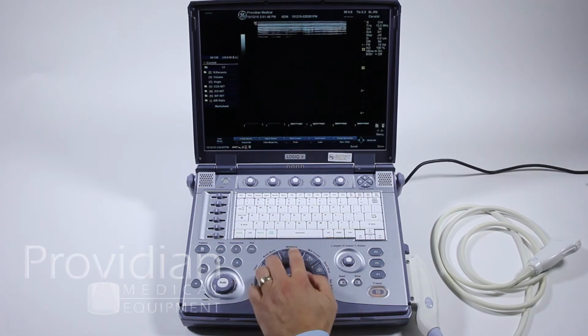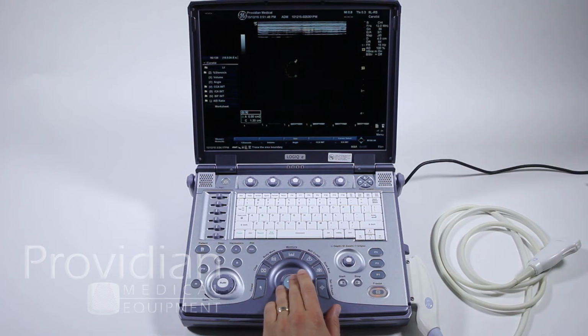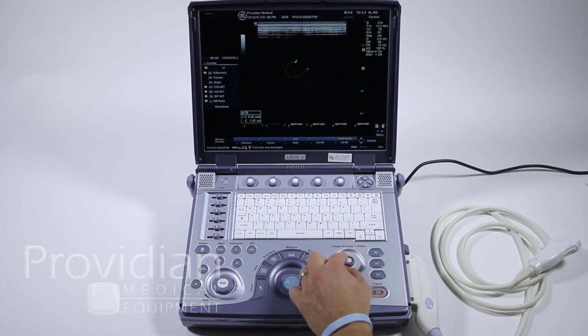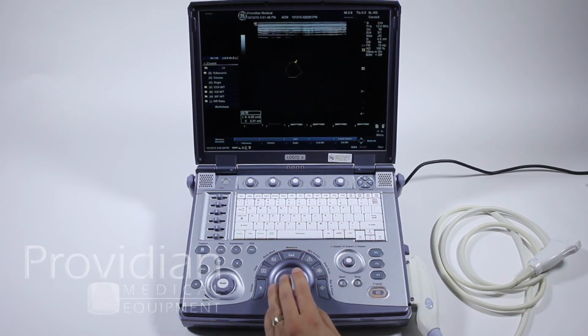For a trace, you're going to press measure twice. First you have your cursor, now you have a little circle. That means you're going to be tracing and you'll get the dotted line to make your trace. If you don't like the measurement you made, you can use this ellipse key to backspace and correct your measurement. Hit set and it completes that trace for you.